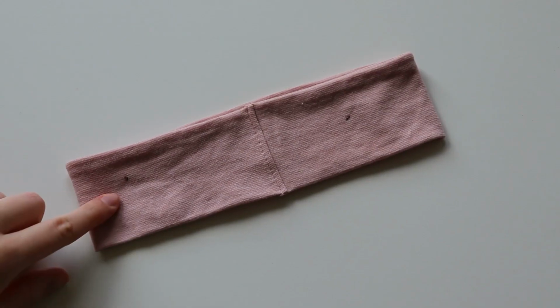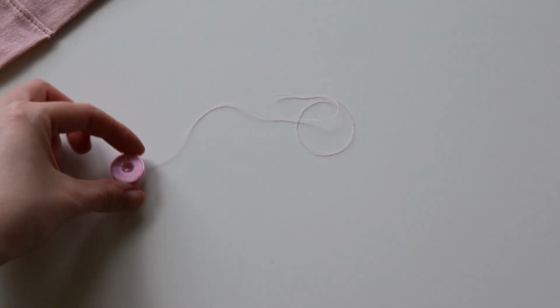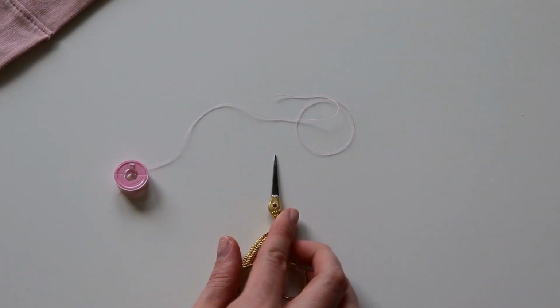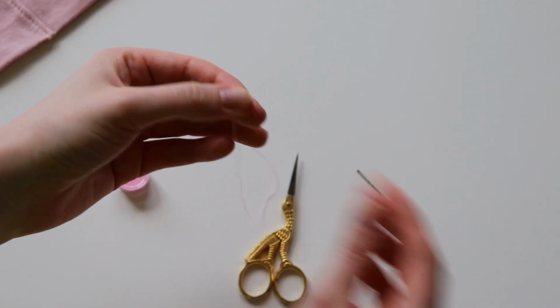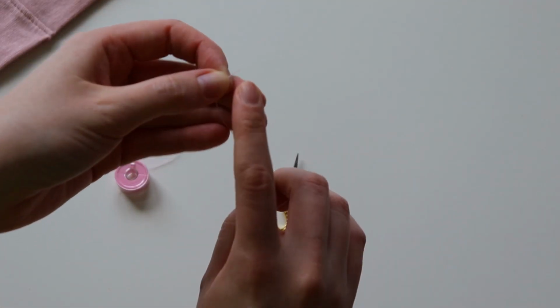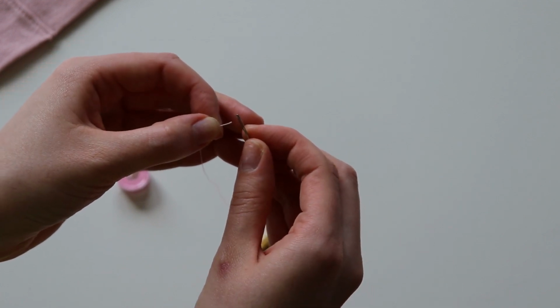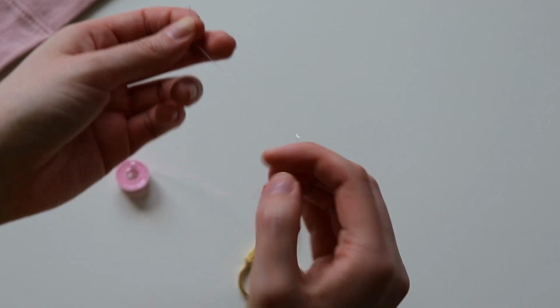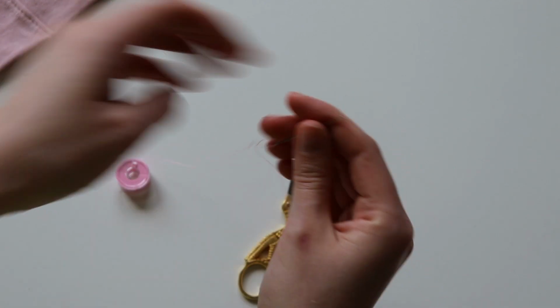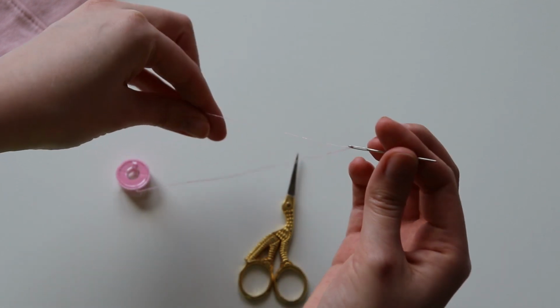But to sew the buttons on, if you do not know how to sew, that is okay. What you'll want to do is get out your thread, some scissors, and a needle. What I would do is take the end of your thread, and if you need to trim this, if it's fraying at all, I do recommend doing so with your scissors, but go ahead and push this through the needle. Once you pull it through, you are gonna want like a double thread like this. So this is pulled through, I have the end over here.